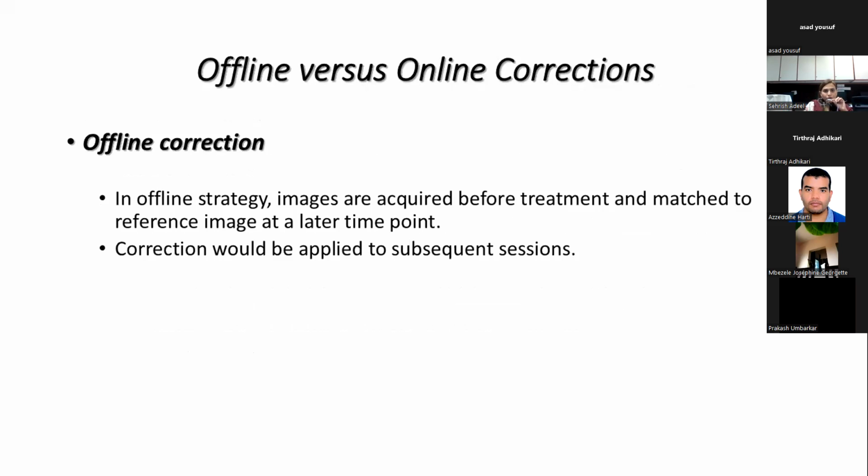For offline corrections, in the offline strategy, images are acquired before the treatment and matched to the reference image at a later time point, and the correction is applied to the subsequent sessions.